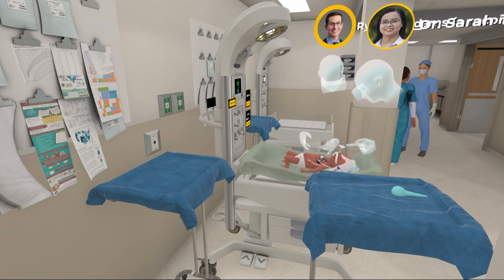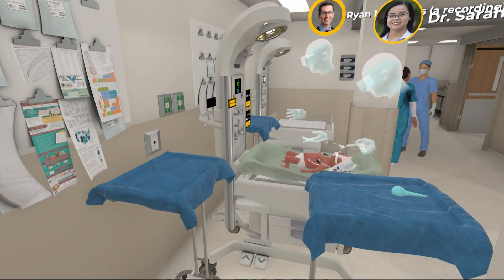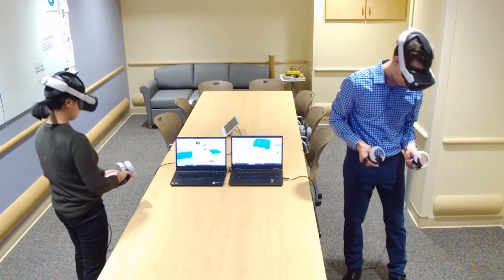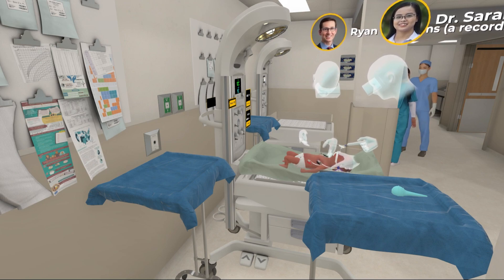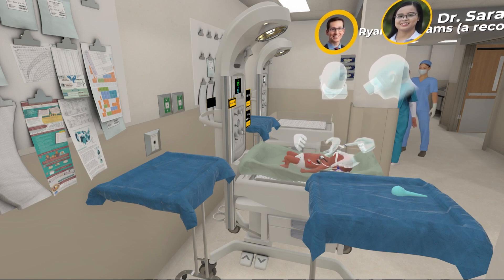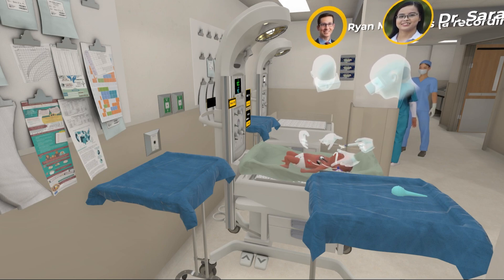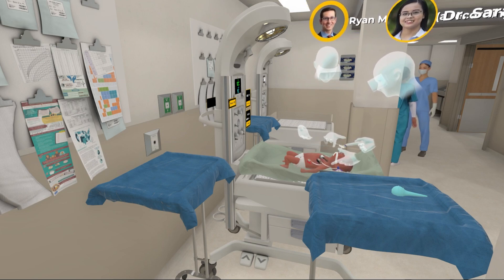I'm going to get the laryngoscope and we just got a color change — I see yellow, which means we're exchanging carbon dioxide. I'm actually seeing chest rise now. Our heart rate's up to 120 and our sats are 90. I'm going to lower the oxygen. We're getting good chest rise, and I'm hearing good breath sounds on both sides — left and right sound equal. There's mist in the tube and I'm seeing the yellow color. Our vital signs are better and the color's improved.